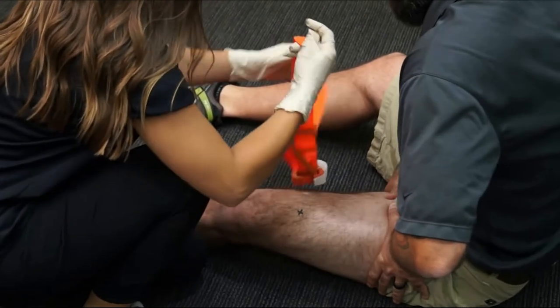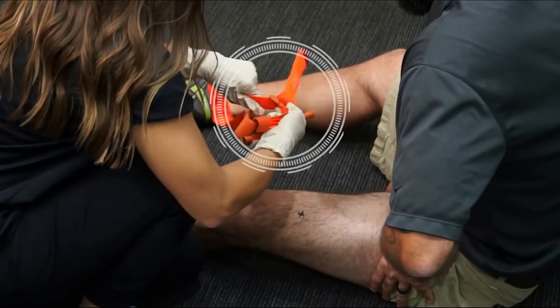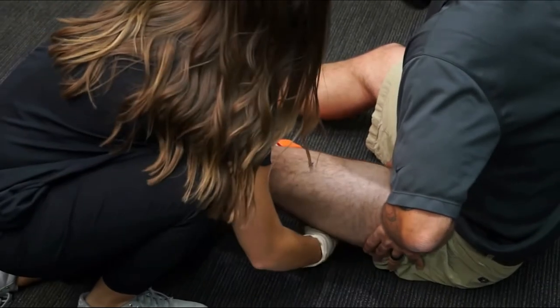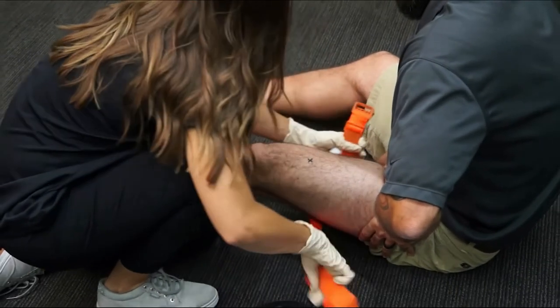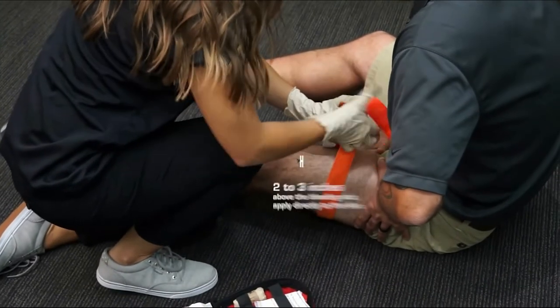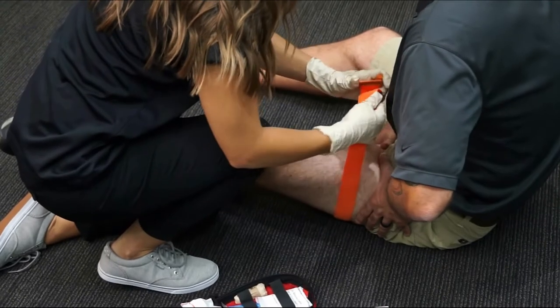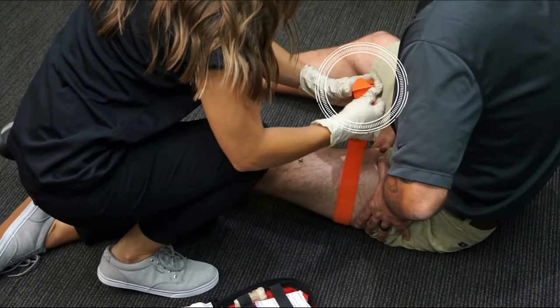For this two-handed application, pull the band out of the CAT buckle. Route the band around the limb. Position the CAT 2 to 3 inches above the bleeding site, applied directly to the skin. Pass the red tip through the slit of the buckle.